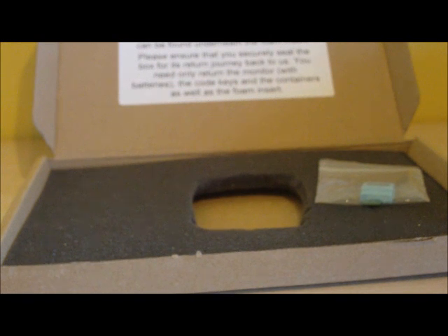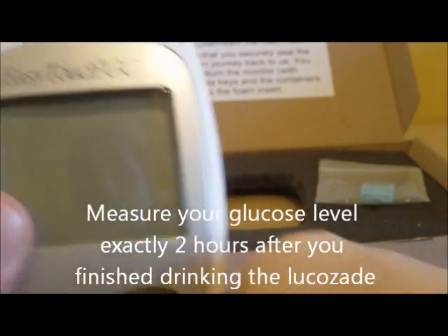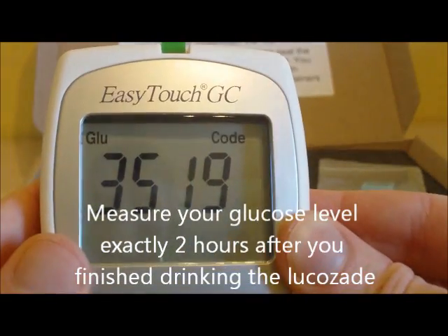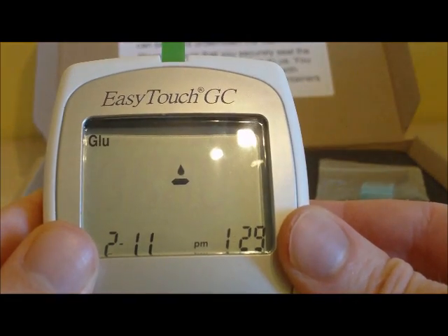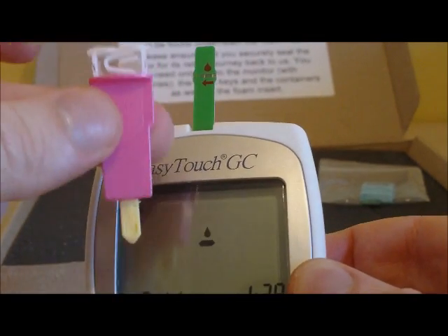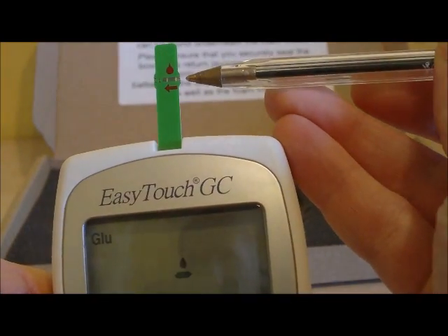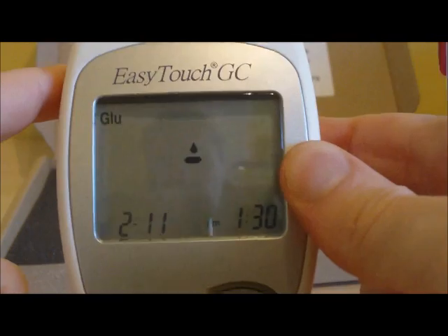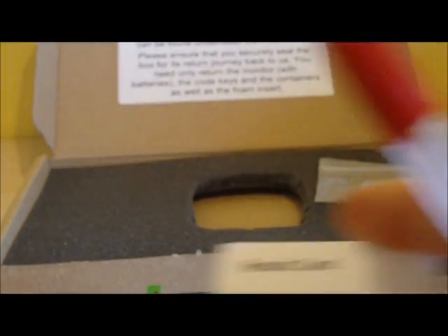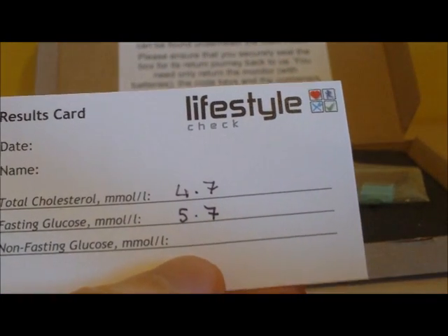Two hours to the minute after finishing your Lucozade, repeat your glucose test by inserting your glucose test strip into the top of the monitor, wait for the blood sample symbol to flash, take your other lancet, prick your finger again and introduce the blood sample to the test strip. Within 10 seconds you will get your non-fasting glucose result. It is non-fasting because you have had the Lucozade at that point, and you can then write it on your results card against your non-fasting glucose level.